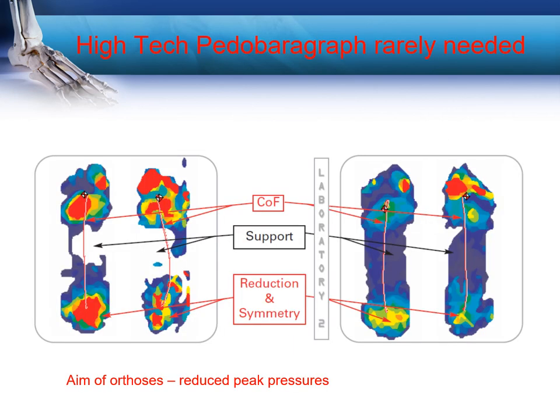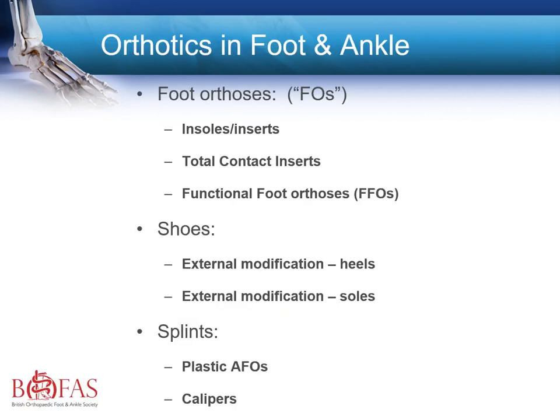This can be measured in a more high-tech method using a pedobarograph, and you can localize the precise areas which are being overloaded, thereby giving you clear instructions as to how to design an orthotic to reduce the peak pressures. So let's consider the full range of orthotics used in the foot and ankle.